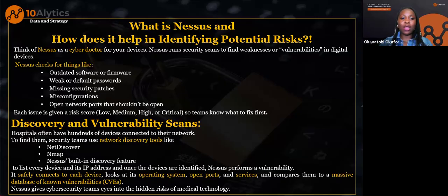Then you also have it check for missing security patches. This is where there's an issue with a particular device or the computer or printer or anything at all in that space, right? And they're supposed to have updated it to get that fix in, and they didn't do it. It checks for that too.